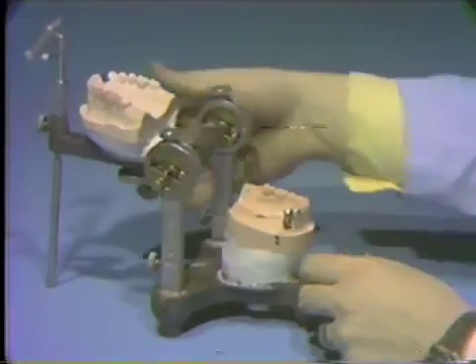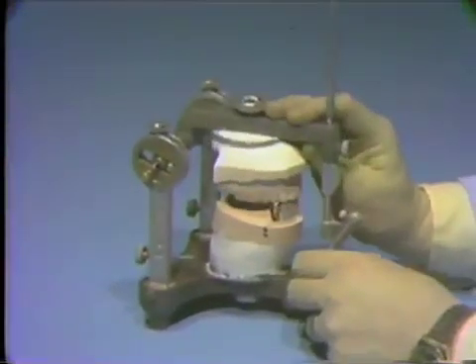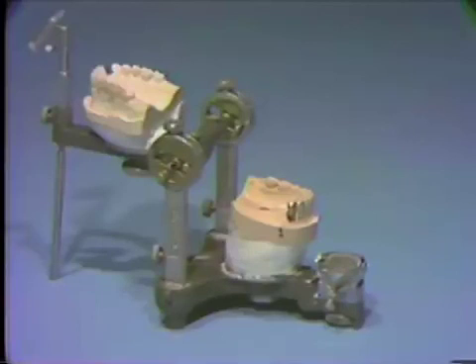Replace the finished crown on the die on the articulator and adjust the occlusion if necessary. The crown should also be checked on the surveyor to be sure you still have the parallel guide plane and adequate buccal retention.